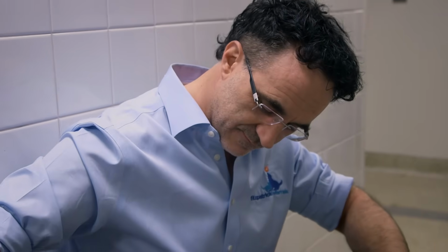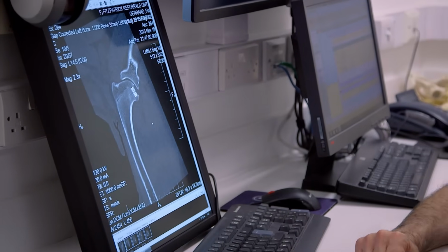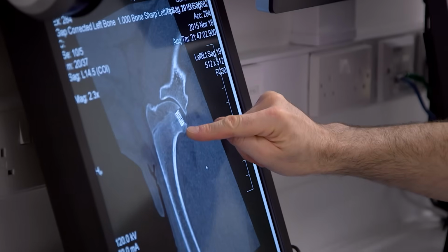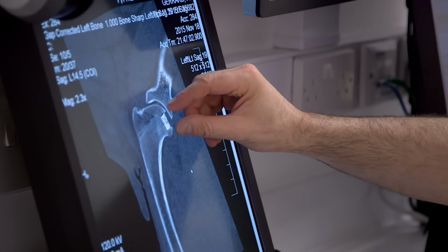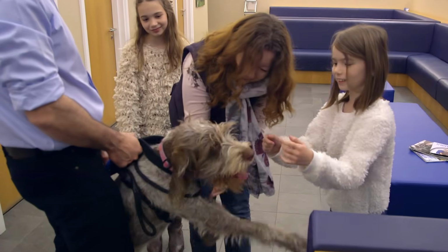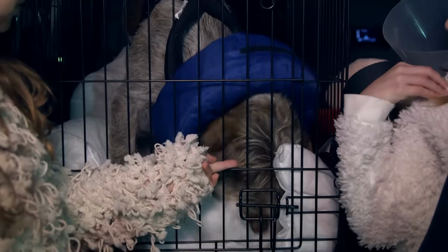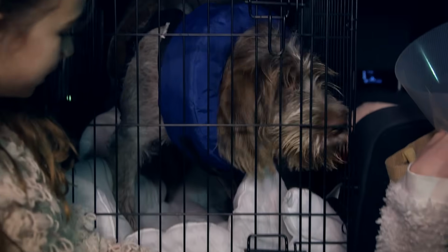It's extraordinary, really. I'm very excited because this is a CT scan of the first time ever in a clinical case, for me certainly, and as far as I know for anybody, where we've put the metal in that the bone is going to physically grow into, and then the cartilage is here, which should grow into a joint surface which lasts her for the rest of her life and grows with her as she grows. Isn't that amazing? Hello, sweetheart. Oh, kiss. She's happy to see you. You've been a good girl. It will be weeks before the family know if the cells are growing. But while they wait, they're thrilled to be taking their youngest member home.